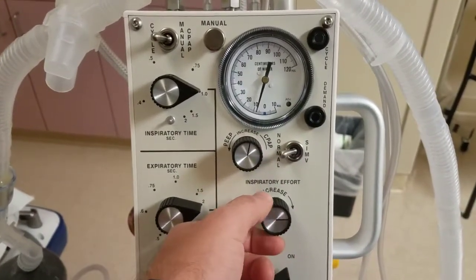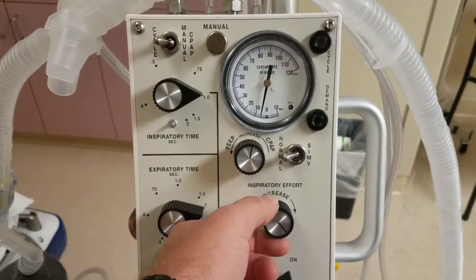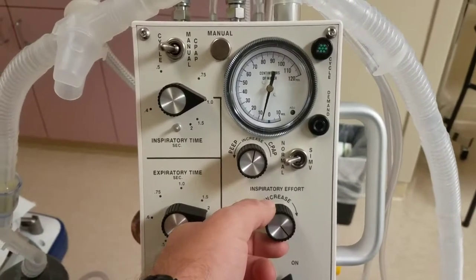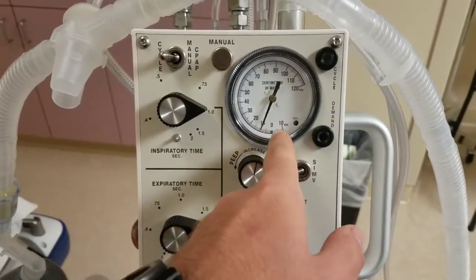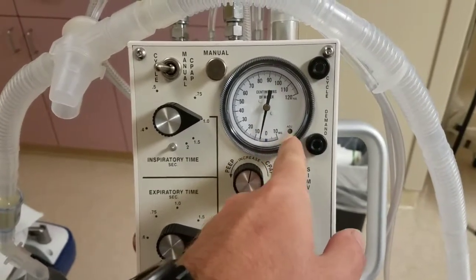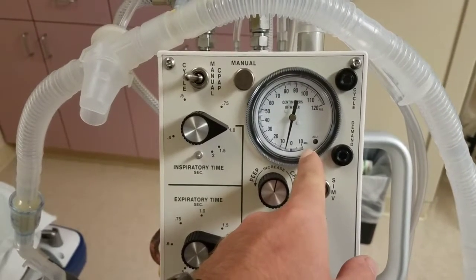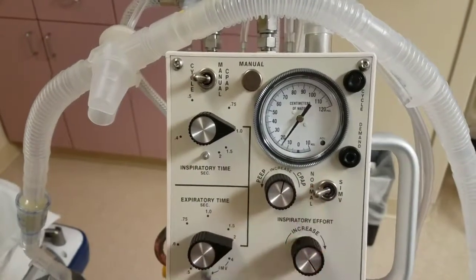So just kind of put the patient on and watch if it's not auto cycling, and when the patient triggers, the breath is given. Also, another thing, you can watch the needle here. If it goes really far on negative numbers from the 0, that means patient is working hard and pulling air in order to trigger a machine to give a breath.